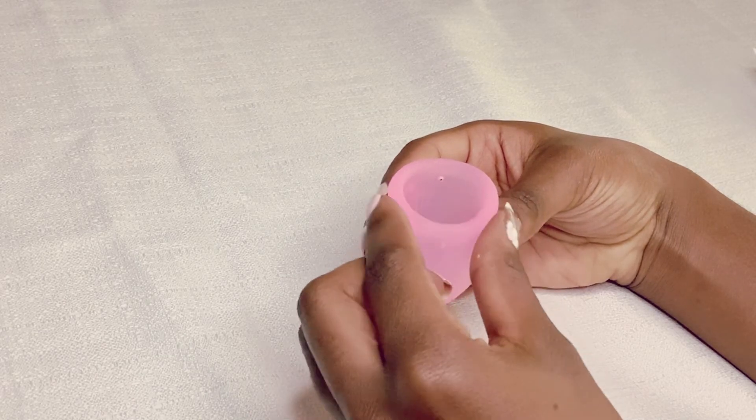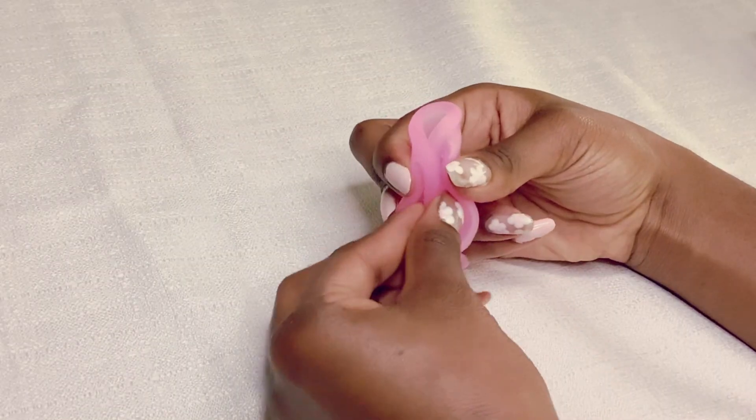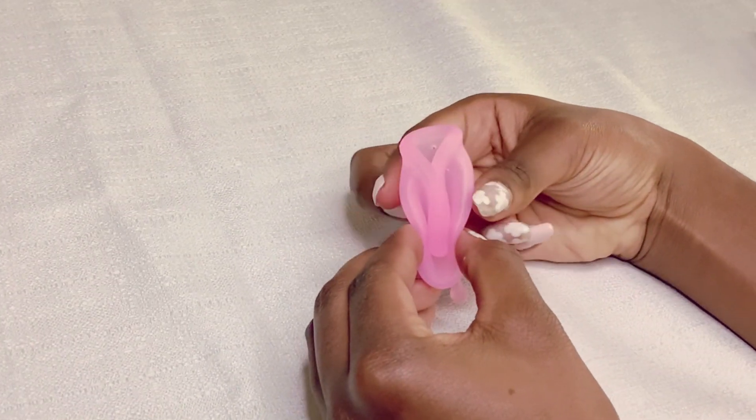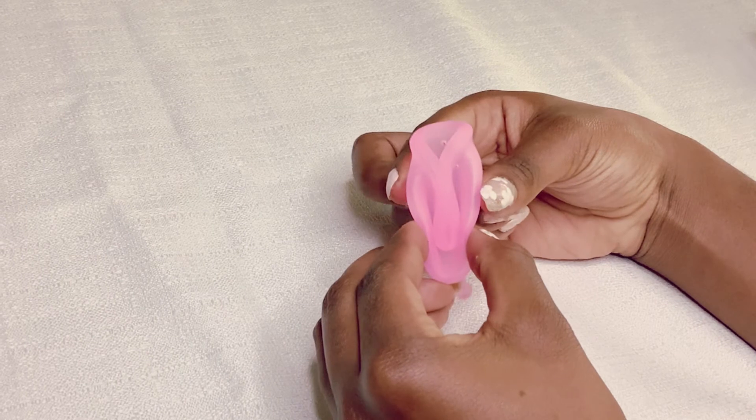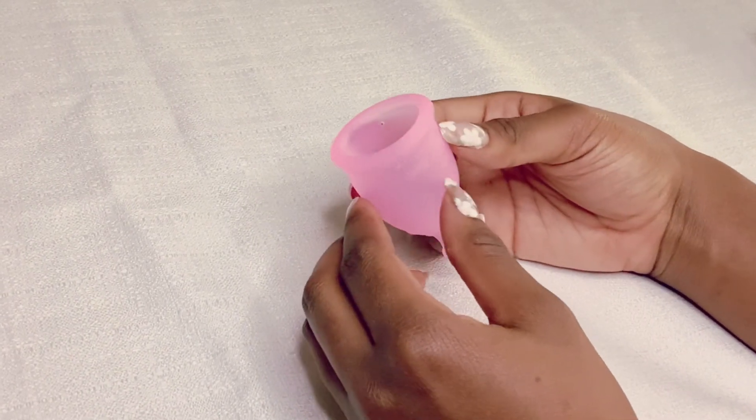So next we have the labia fold. This fold is good if you're having trouble getting your soft cup to pop open. To do the labia fold, you take the edge of the cup, pinch it, and fold it down to the middle of the cup. Then squeeze the side around it, kind of like a taco. You will notice a nub sticking out of it, and you can push on this nub to open the cup.